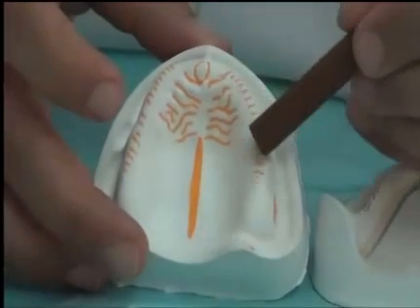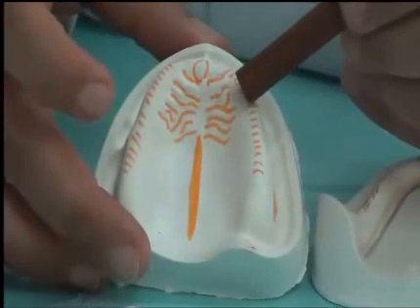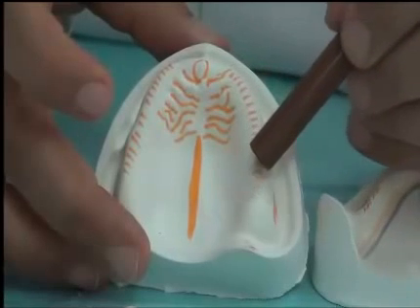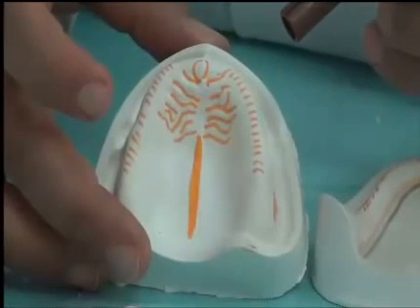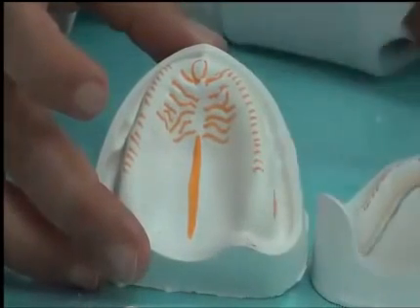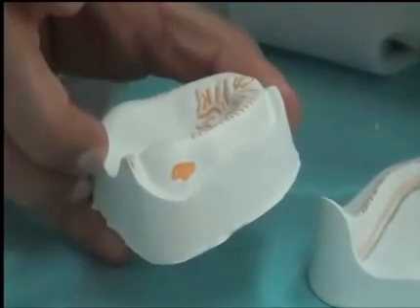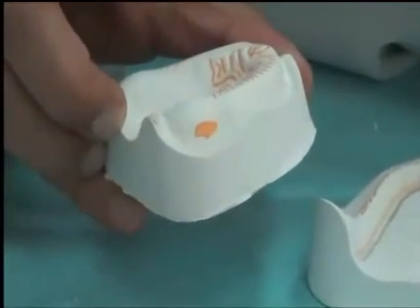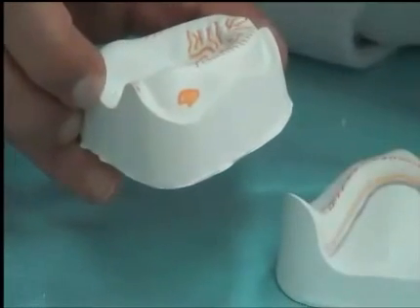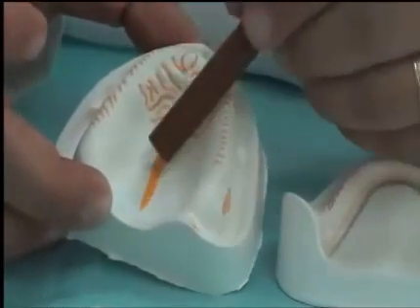The crest of the ridge, if well formed, still has under it cancellous bone that is highly resorbable, so the crest of the ridge is an area of relief. If the crest is also sharp, we add to that a sharp bony projection. But those are for what we call knife-edge ridge, and these are more common in the lower. We'll look at them in a moment. Also, if we have undercuts, areas of undercuts are usually covered by thin mucosa that is easily traumatized. Although the bone beneath them is good, the thin mucosa is very vulnerable, so it can be traumatized under pressure of the denture. So these areas should be relieved.